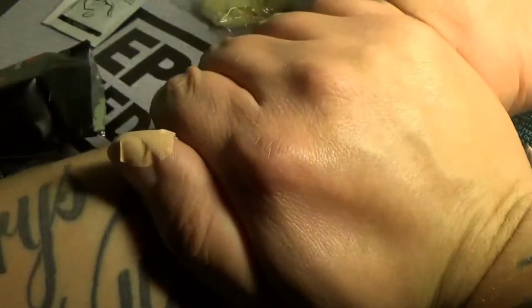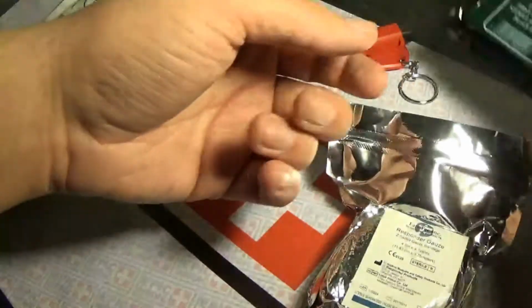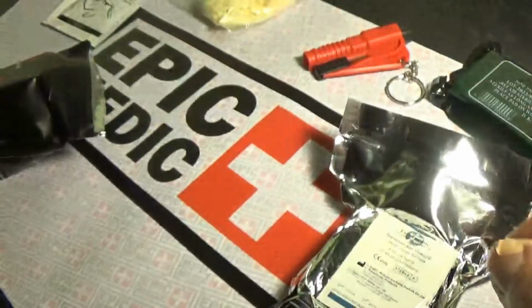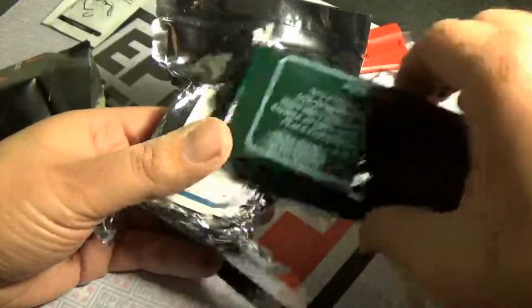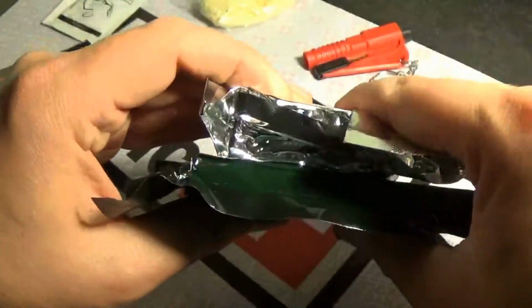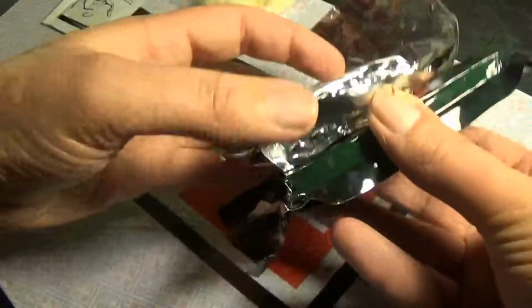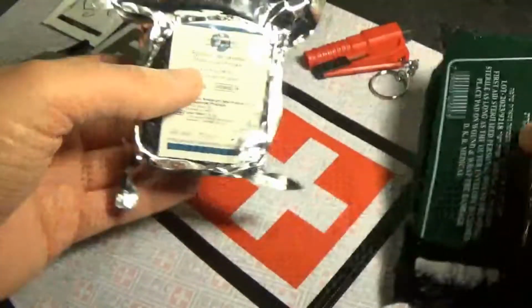Once I've covered the wound and clogged it full of this gauze, the gauze will be soaking up that blood and expanding further and further. Then I can get my Israeli dressing, place it over the top, and wrap it around, again applying more and more pressure. But that is for a separate video, and really smart. So these two can control some very severe bleeding, and look at the space it takes up. Absolutely nothing. So bits of vital kit here.